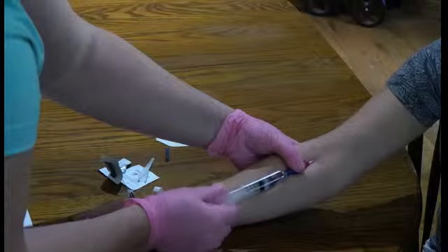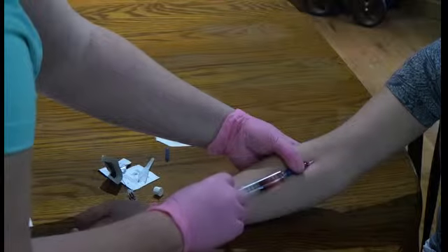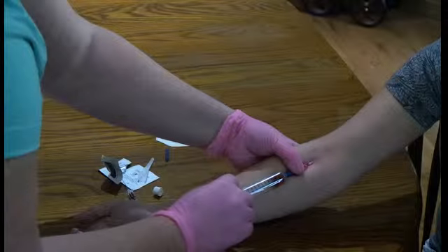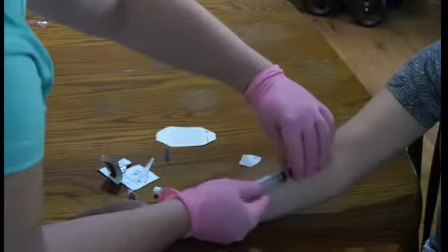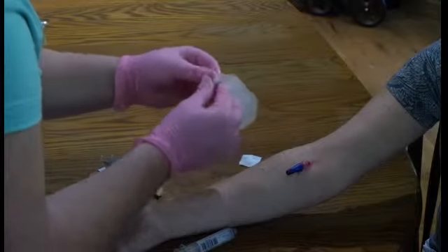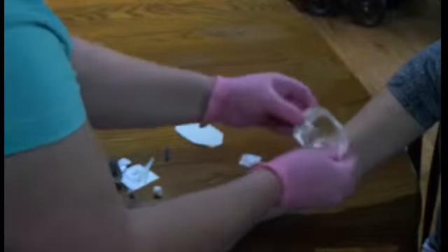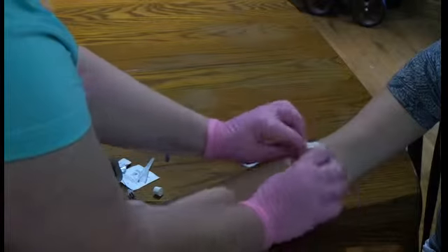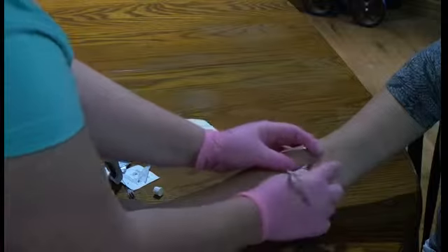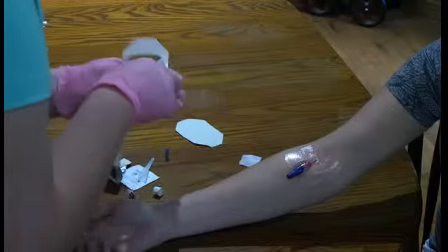Again, sometimes you can backflash to make sure that there's some blood in the catheter and that you got a backflash. Go ahead and flush it the rest of the way in. When you're finished, you're going to secure it, either with tape or a securing device, so that it stays in the patient's arm. And that is how we start an IV.